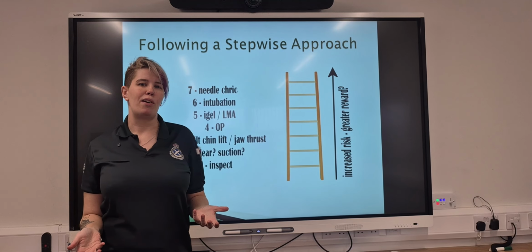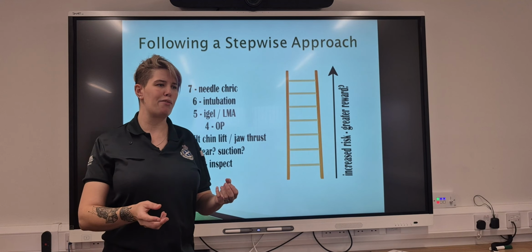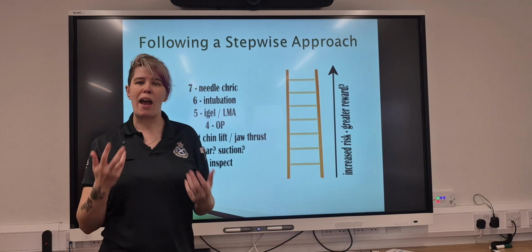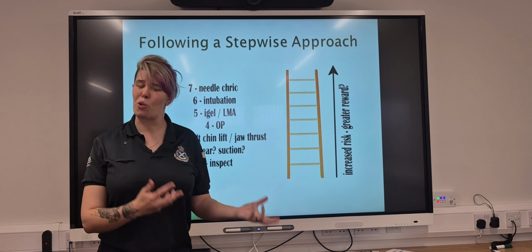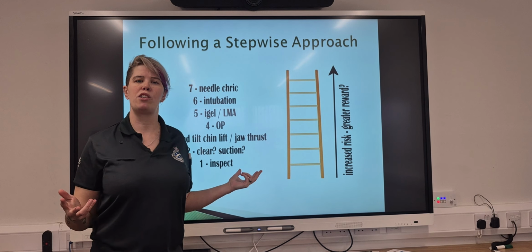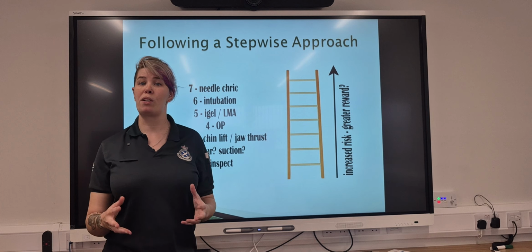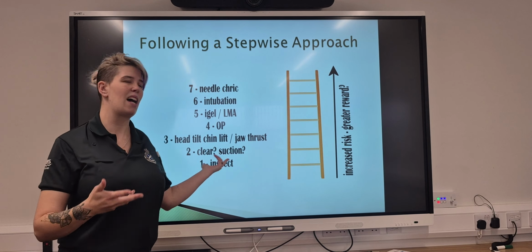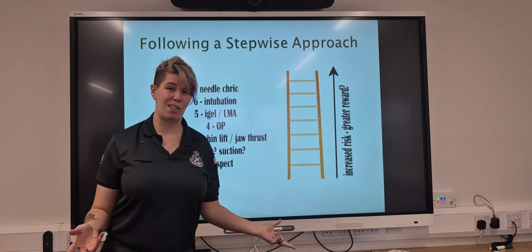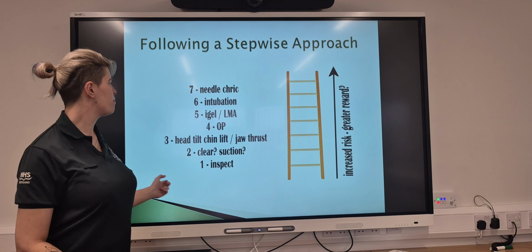But most of the time, if a patient isn't being repeatedly sick, or if it's not a drowning patient, anything like that, we will stick to an OP because it's effective and it's easy and quick to insert as well. So don't think that just because you guys carry OP airways and you're not working with i-gels or anything like that, that it's not an effective way of managing an airway, because it is, and you'll find a lot of the time that that's as far as we'll go up the ladder, because the benefits far outweigh the risks and the time it takes to insert an intermediate or advanced airway.